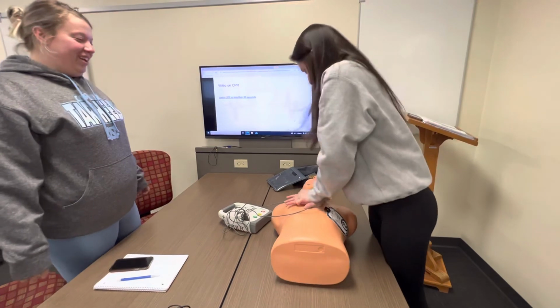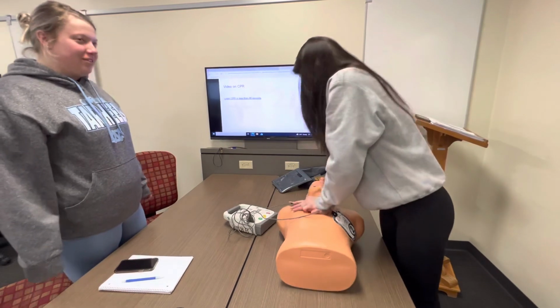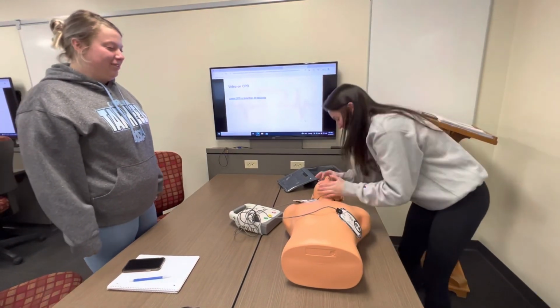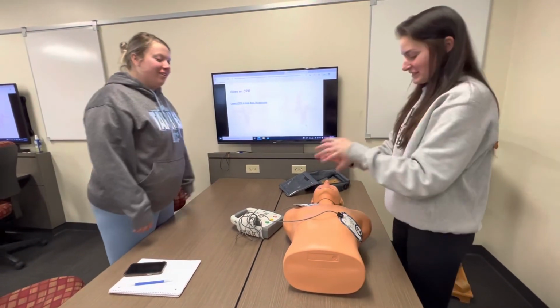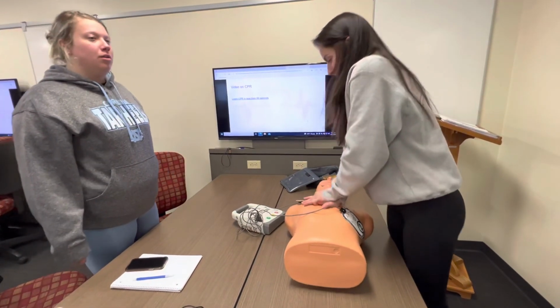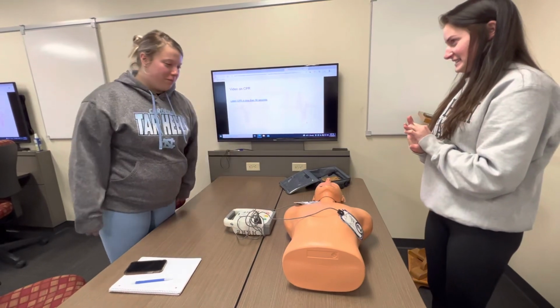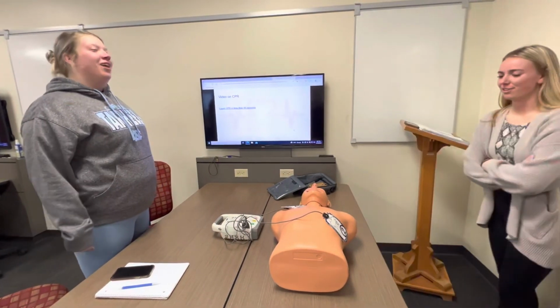Okay, on the 4th. I think so. Shock him again or no? Oh, keep going. Okay, we'll see. The first responders are almost here and they're going to take over. Oh, it's beeping at us. Okay. Shock advised. Clear. Beep. Alright, we're good. And the first responders are here. Get out of the way.